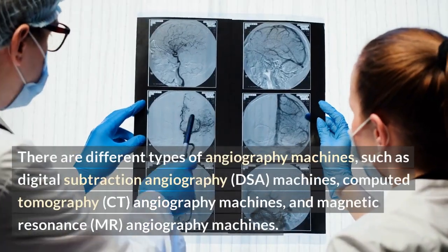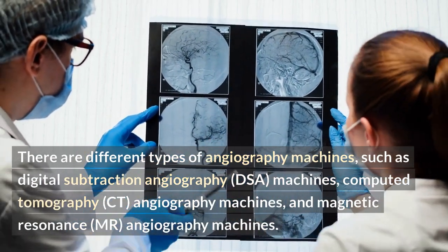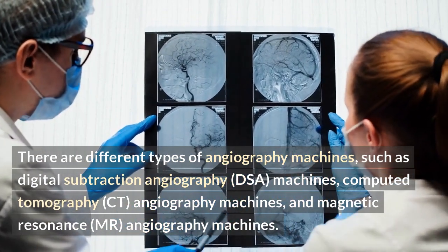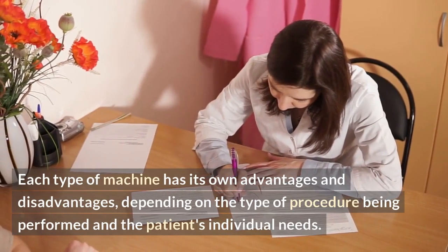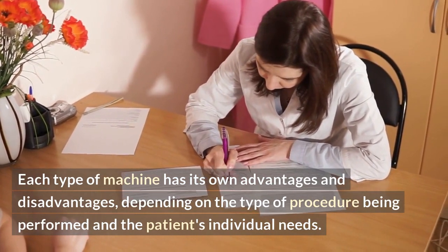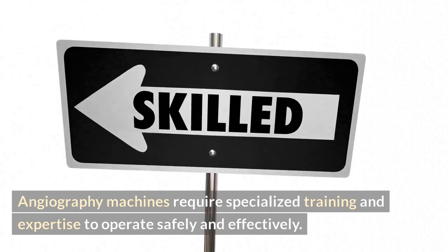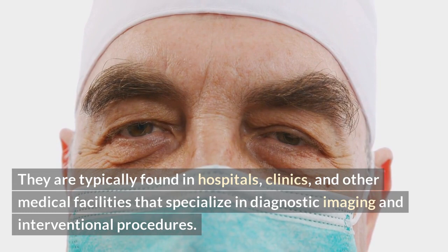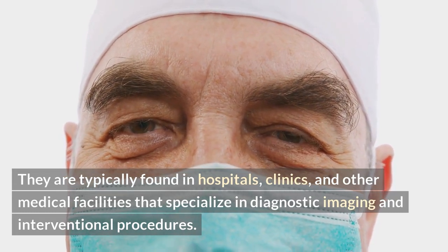There are different types of angiography machines, such as digital subtraction angiography, DSA, machines, computed tomography, CT, angiography machines, and magnetic resonance, MR, angiography machines. Each type of machine has its own advantages and disadvantages, depending on the type of procedure being performed and the patient's individual needs. Angiography machines require specialized training and expertise to operate safely and effectively. They are typically found in hospitals, clinics, and other medical facilities that specialize in diagnostic imaging and interventional procedures.